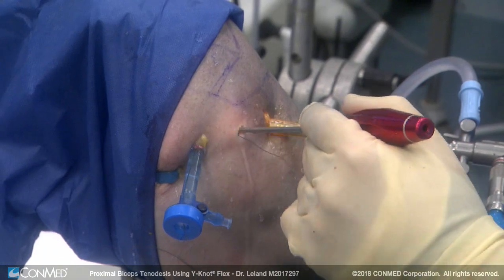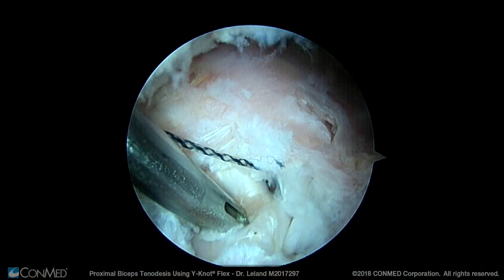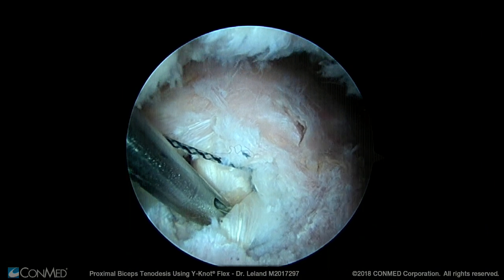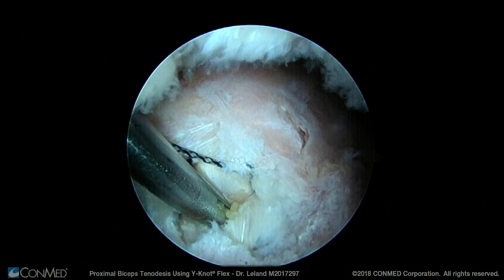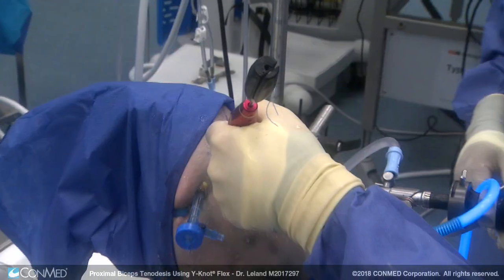Next we insert the Y-Knot Flex through the anterior lateral portal perpendicular to the biceps tendon, going directly into the bone. We drill with the Y-Knot Flex drill and then insert the Y-Knot Flex anchor directly through the center of the biceps tendon. Because this is only a 1.3mm anchor, it only creates a very small hole through the center of the biceps tendon.